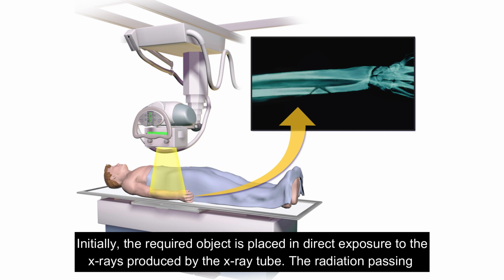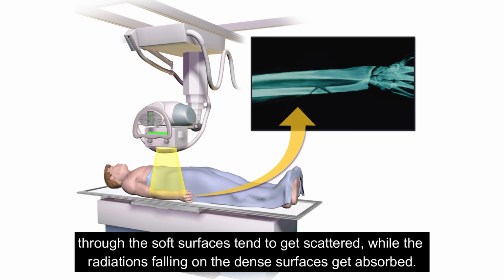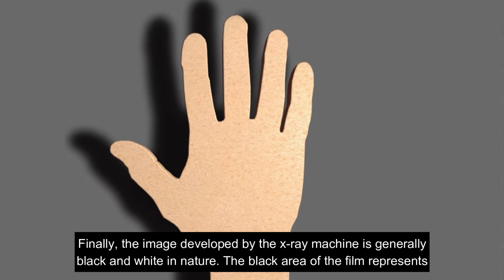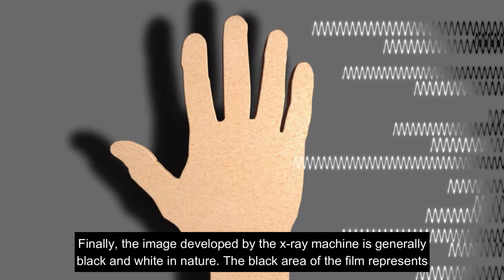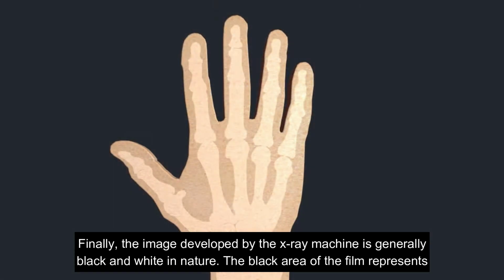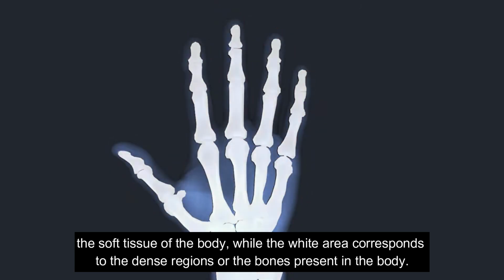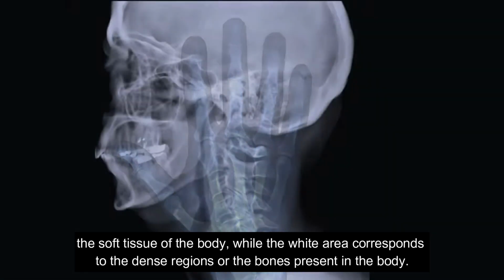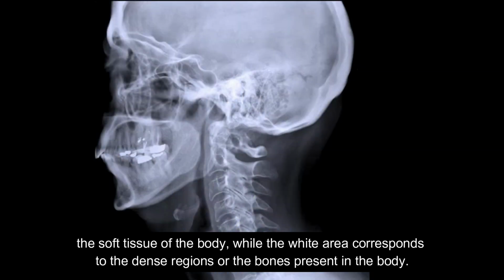Initially, the required object is placed in direct exposure to the X-rays produced by the X-ray tube. The radiations passing through the soft surfaces tend to get scattered, while the radiations falling on the dense surfaces get absorbed. Finally, the image developed by the X-ray machine is generally black and white in nature. The black area of the film represents the soft tissue of the body, while the white area corresponds to the dense regions or the bones present in the body.